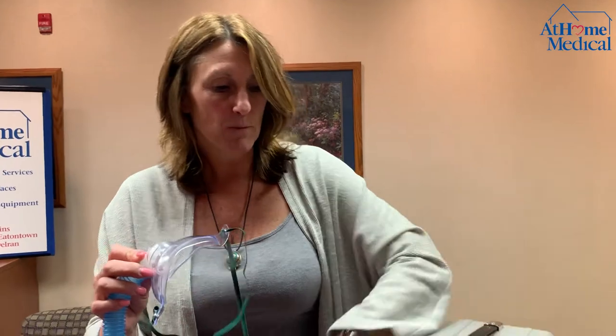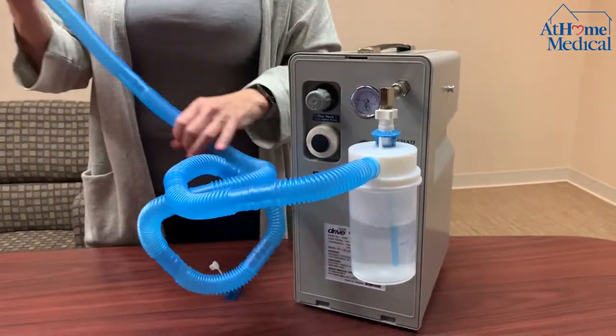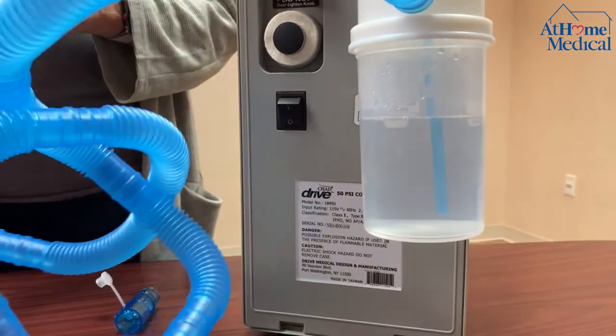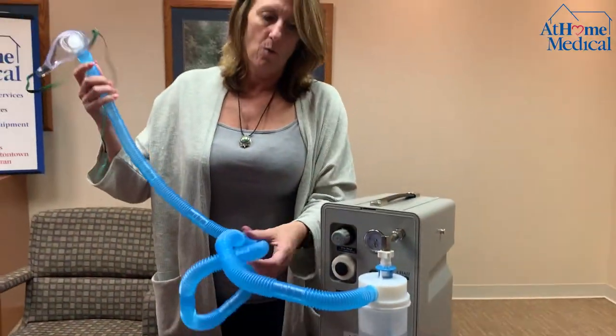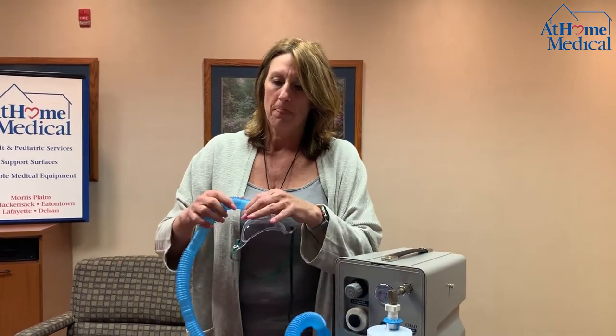For cleaning: every other day you fill the bottle with distilled water, but you also want to take it apart and clean it with soap and water once to twice a week. You're going to replace the tubing, and every day you're going to take the mask and clean it with regular dish detergent and water, then replace it onto the new tubing.